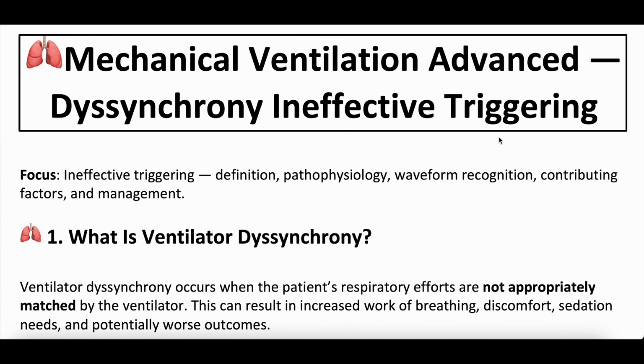We'll be talking about what ineffective triggering is. We'll be talking about what causes it, waveform analysis, how to approach it, how to fix it, all that good stuff.